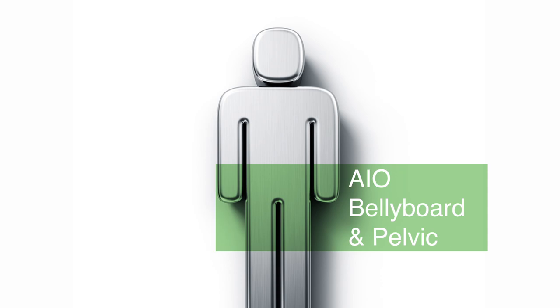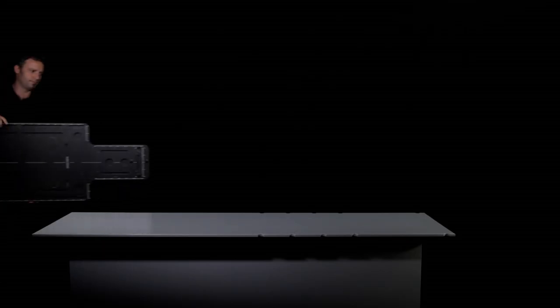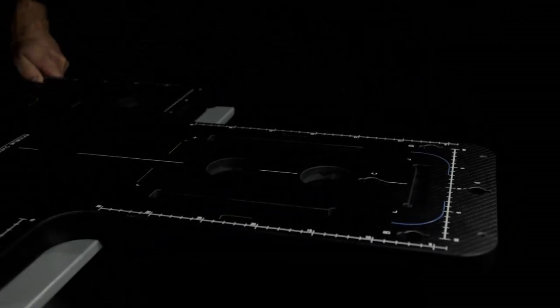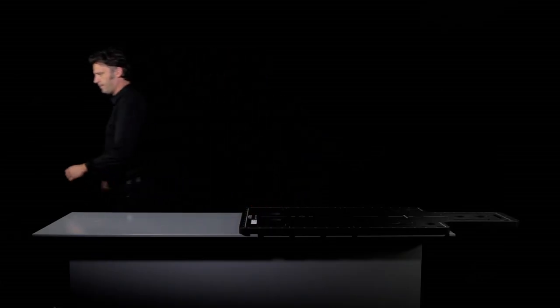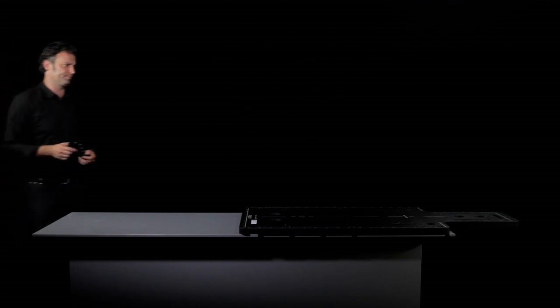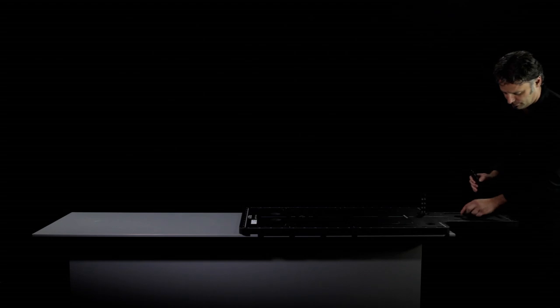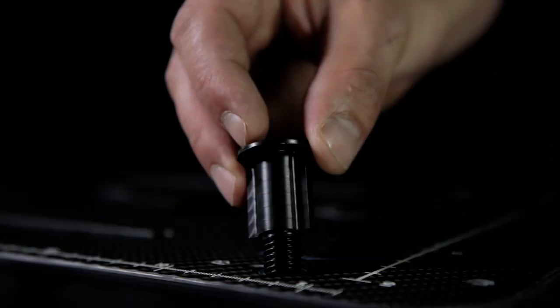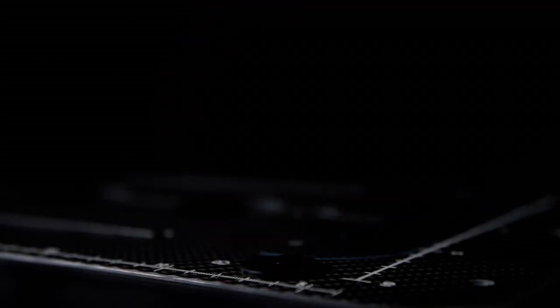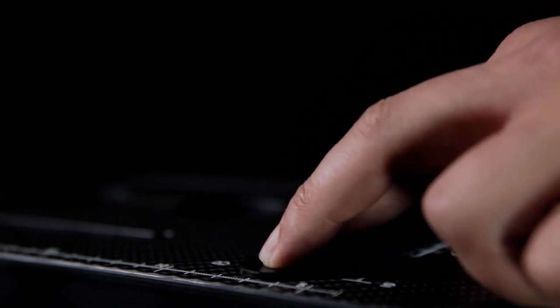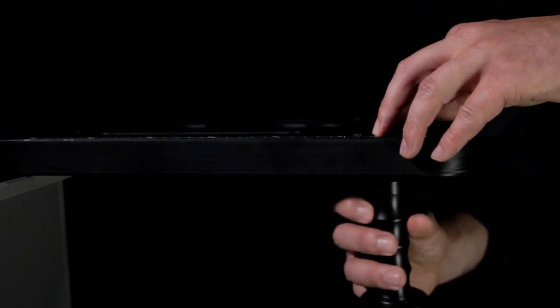AIO Bellyboard and Pelvic. The AIO Bellyboard is usually used for patients in a prone position. To use it, first you need to put the AIO base plate so that it overhangs the therapy table to make room for the two handgrips. Then attach the two handgrips to the AIO base plate. First of all, place the screw of the handgrip into the holes marked B and D in the base plate. Then screw the handgrip into the thread from underneath.